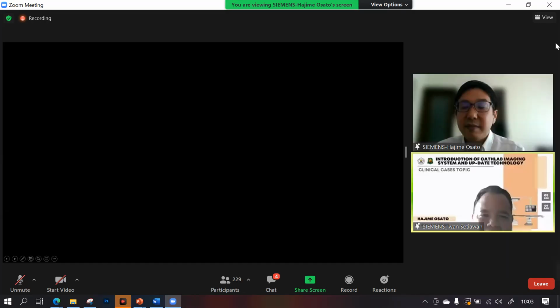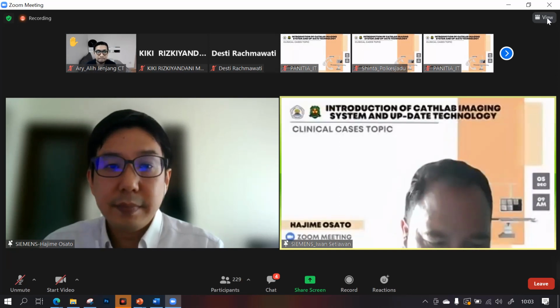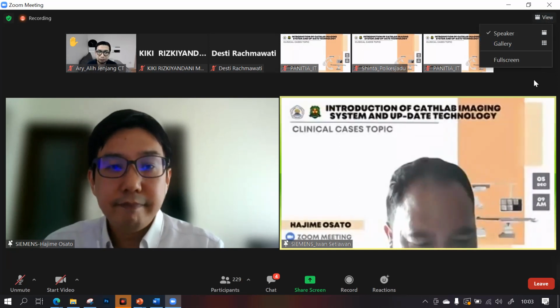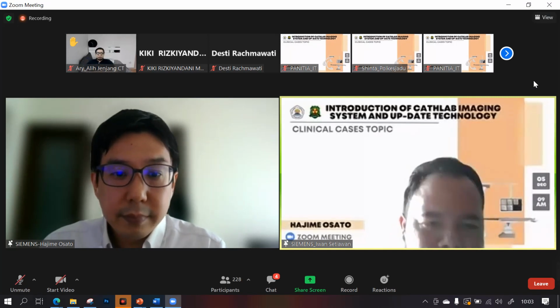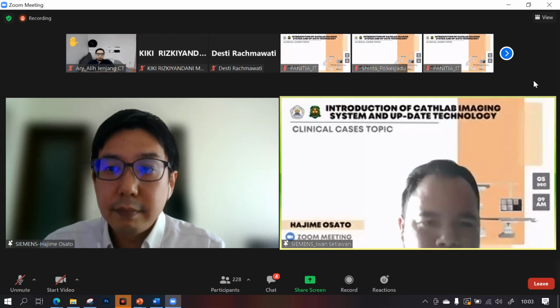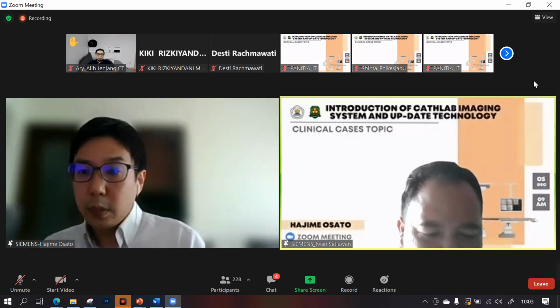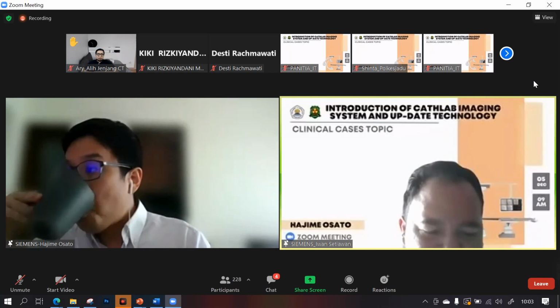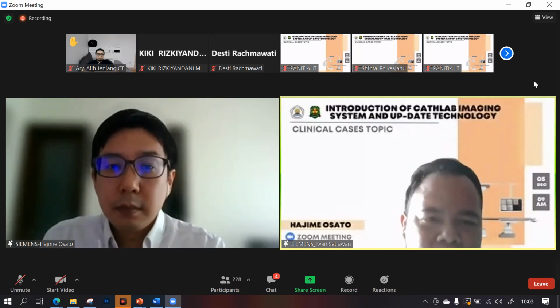Actually, from the participants or students of our college, we already have around 5 questions. Question number 1 is coming from Bu Devi, and I believe Bu Devi is quite familiar with the Artis Q system. She has been working for decades in the Cardiac Center Hospital in Jakarta. The first question is, where can we find Clear View in the Siemens Artis Zee system, since we are facing a lot of requests from the cardiologists in applied?